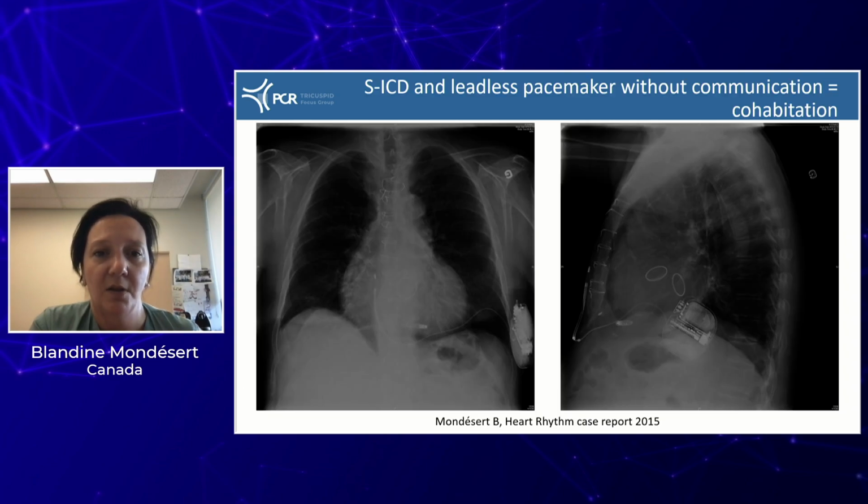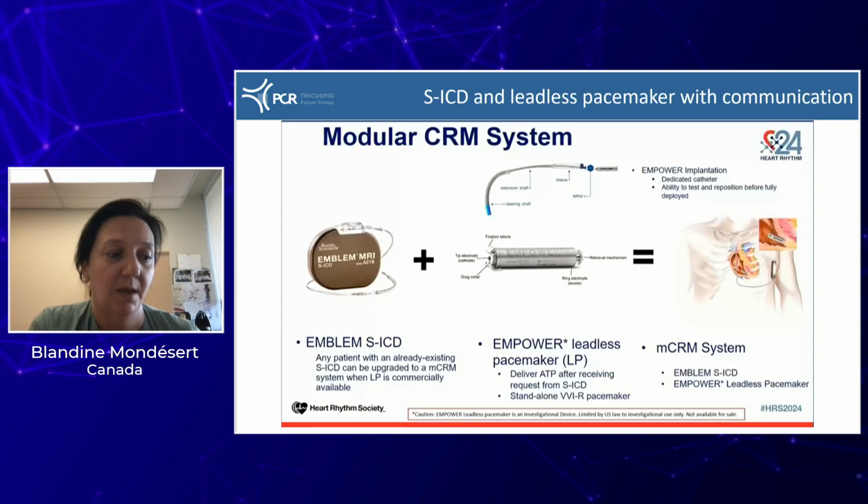Here is one of the case reports that we did more than 10 years ago now, with the first sub-Q ICD and leadless. That was a NanoStim at that time. There is no communication between the two devices, but there is cohabitation and it's feasible.